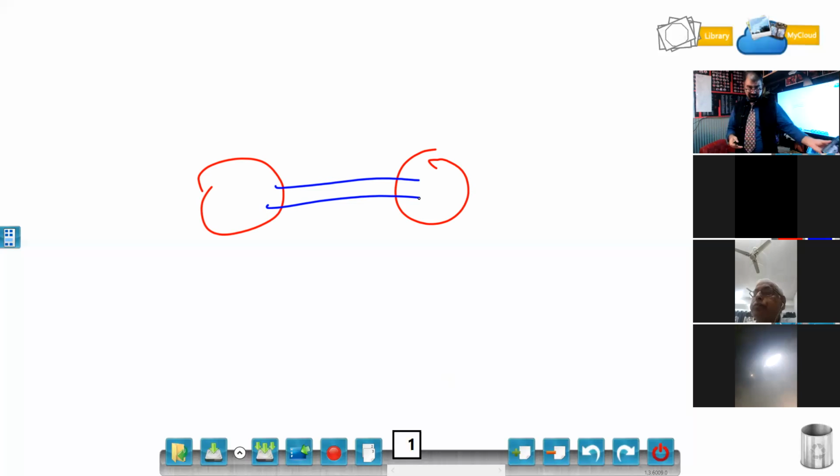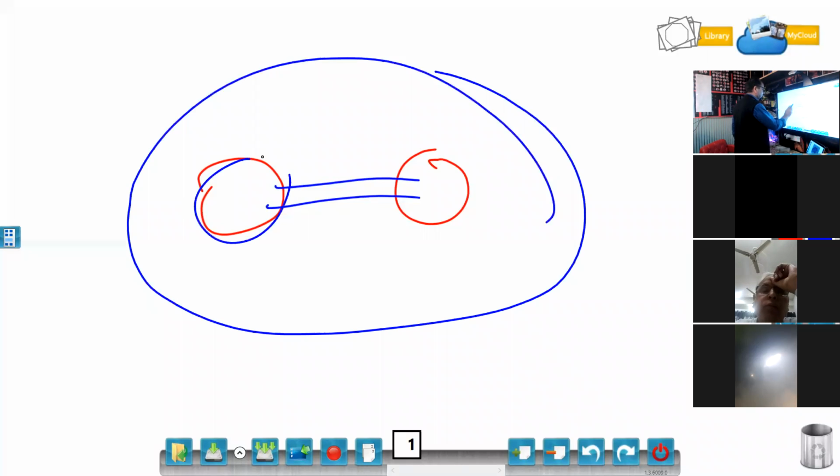Sultan. Cross section. Dr. Asha, Dr. Pankaj, Dr. Sanjay, Dr. Premlata, Dr. Kailash Prasad, and others. Very good. Cross section, because in cross section only I can see two kidneys and I can see this connecting bridge.